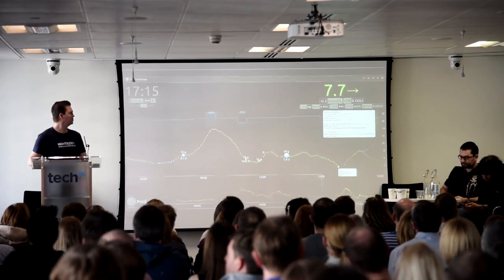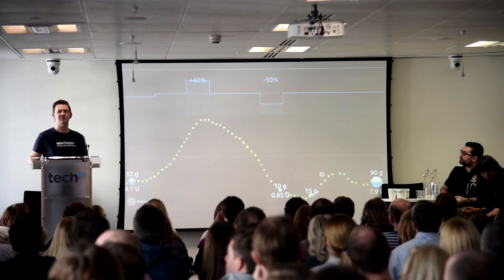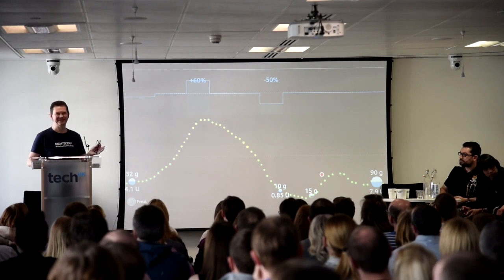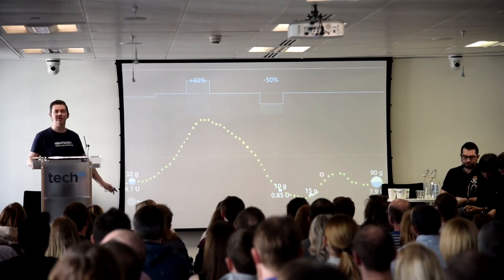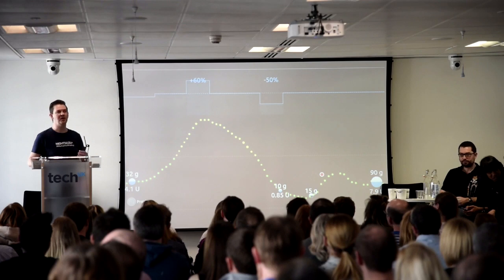We've got some more information. If we just zoom in, at the top there we see the blue line, that's the basal rate, and we can see a couple of TBRs that my daughter's done. My daughter's 17 now, so I don't really have very much control, or any control, over the management of what she does on a day-to-day basis, and that is totally the way that I want it. I want her to do it all, but I want to be able to see when there's a problem, to be alerted when there's a problem.